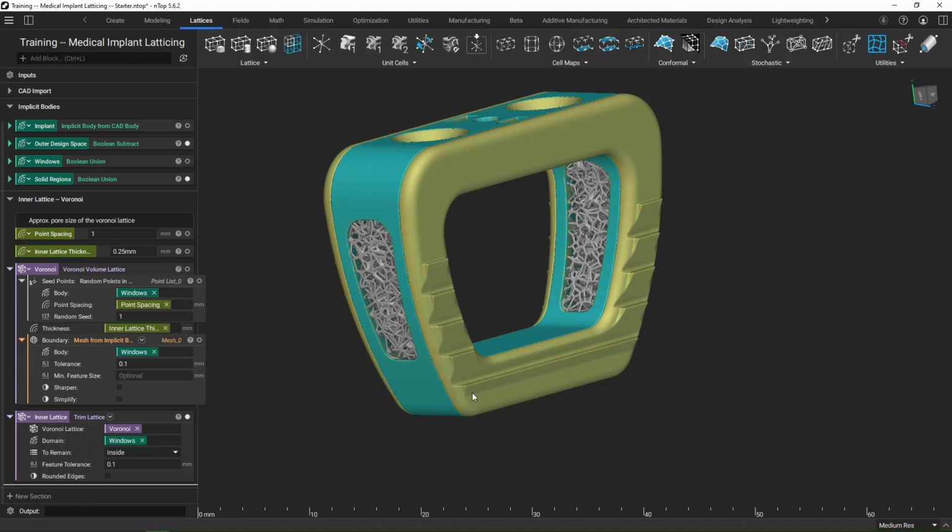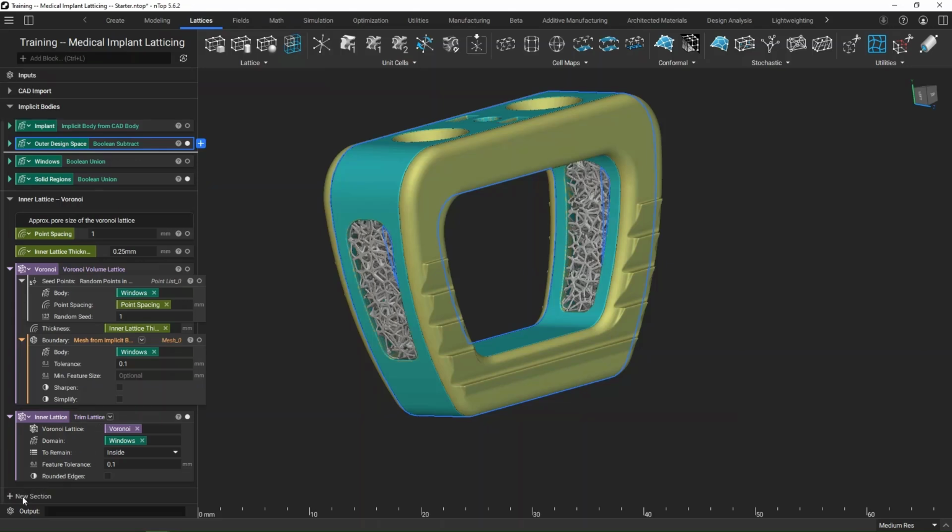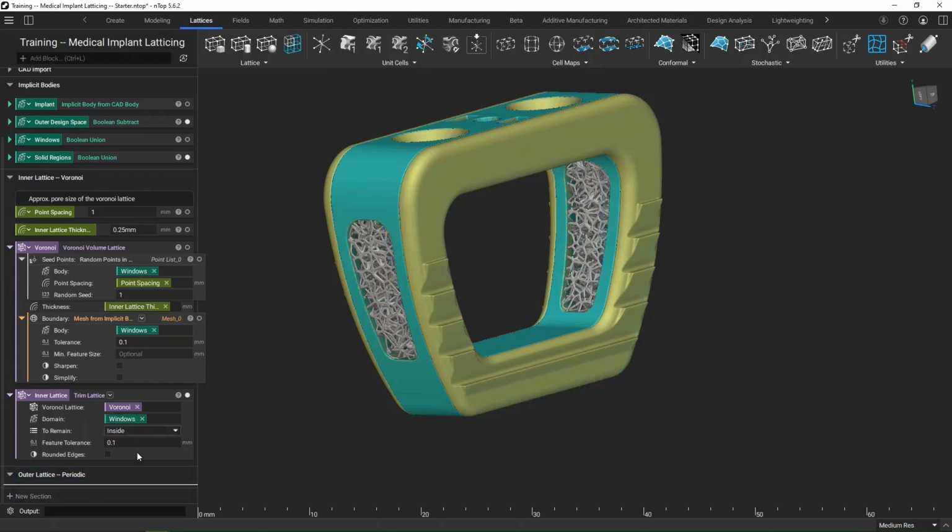Next up, we're going to focus on that lightweighting. So this blue region here, pretty bulky. Maybe we don't need that much material, so we can replace it with a periodic lattice. So I'm going to go ahead, add another section. This is going to be my outer lattice, and we can call that periodic, just so we know what we're working with.